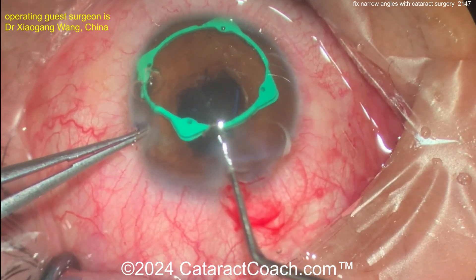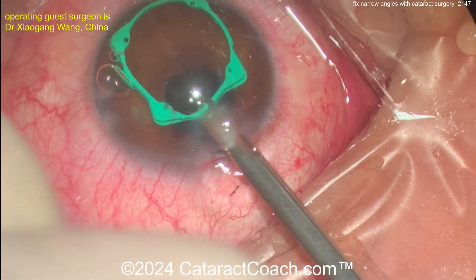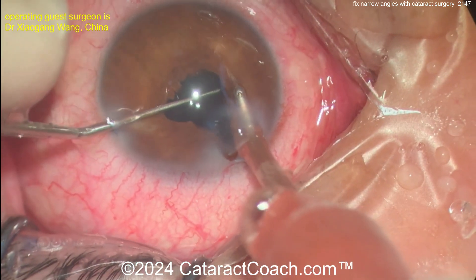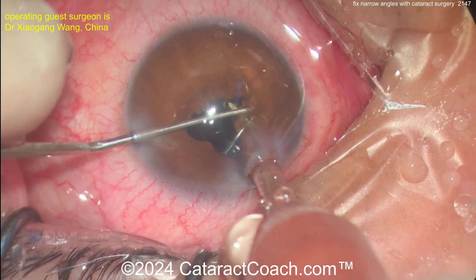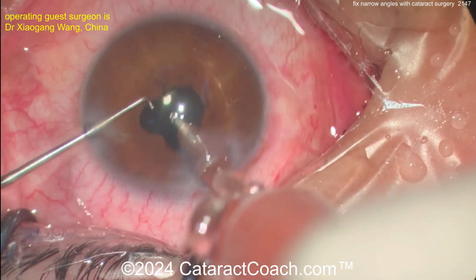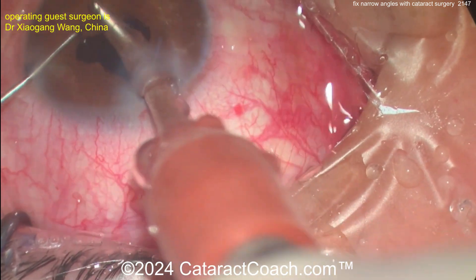It's normal to see some iatrogenic iris damage at the pupil margin, because this was a very tiny pupil and significant effort was needed to expand it. You can get microsphincterotomies — small tears in the iris sphincter — and that's okay, it's to be expected. Warn the patient ahead of time that iris defects can happen.